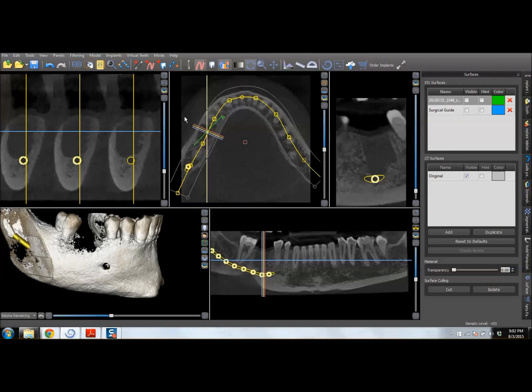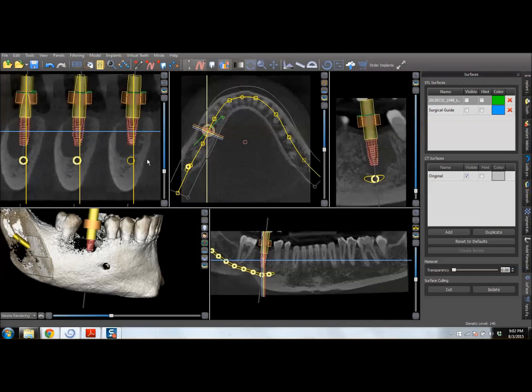The way this process works: you would open up the CT scan, you would map the patient's nerve if you're placing in the lower, and then you would plan your implant position. I've already done that in this case.